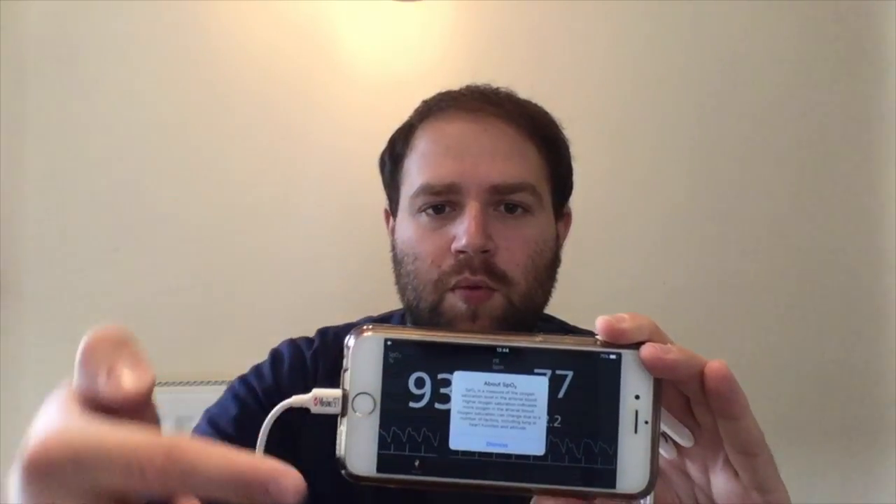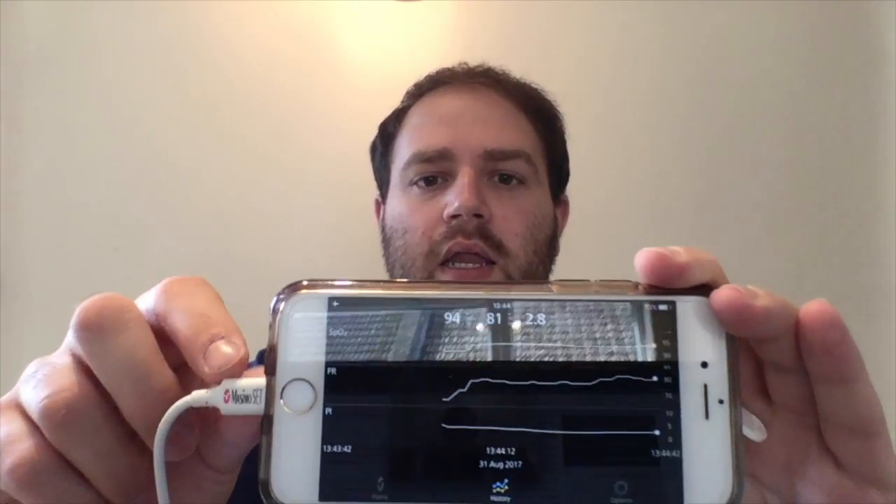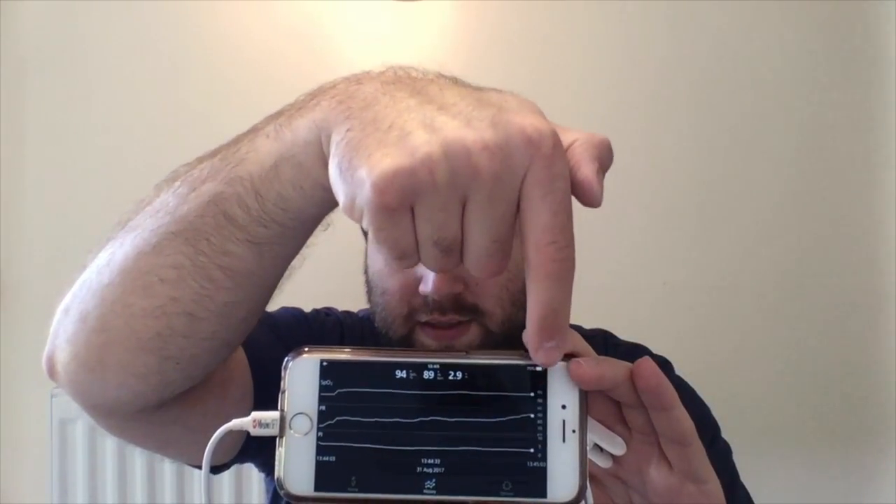If you tap on any one of these parameters, the app will open up with some interesting information about that specific parameter. Here we have the history, so the trends for SpO2, pulse rate, and perfusion index. You can change the parameters you want to see on this screen in the settings menu. The scale will adjust itself dynamically based on the measurements of the device.